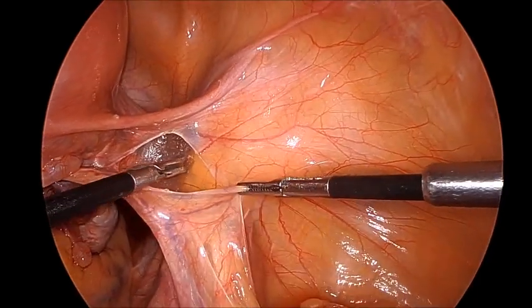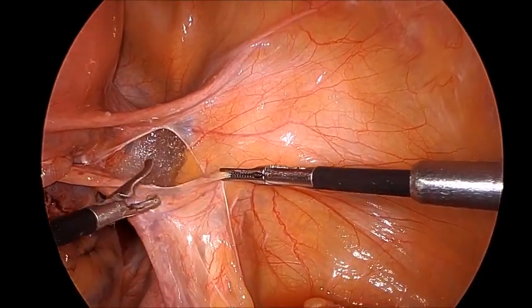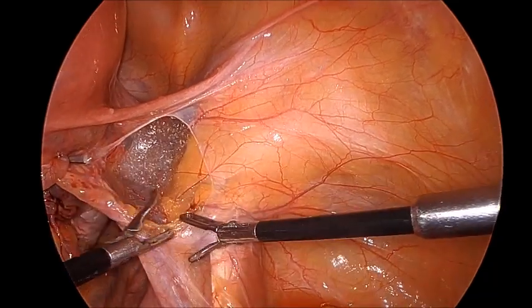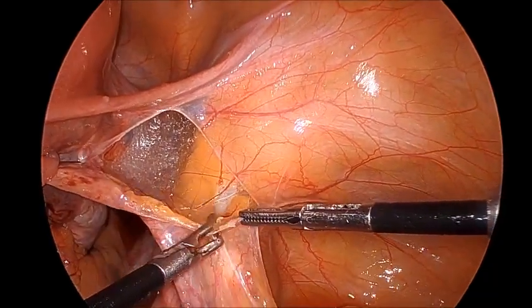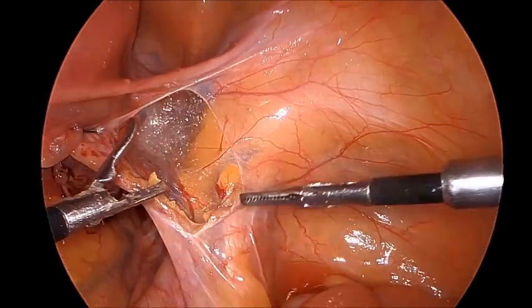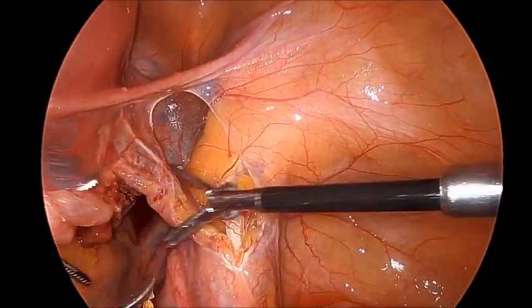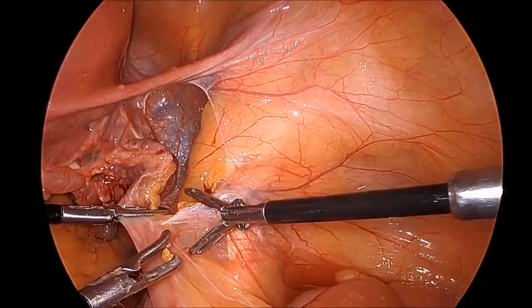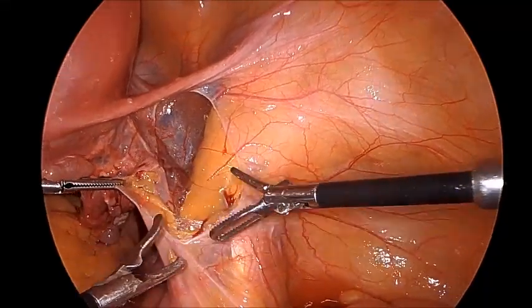Once the peritoneum is incised, the further dissection happens by blunt dissection. You move your instrument in a longitudinal way and you do the dissection by opening up the prongs of your instrument.